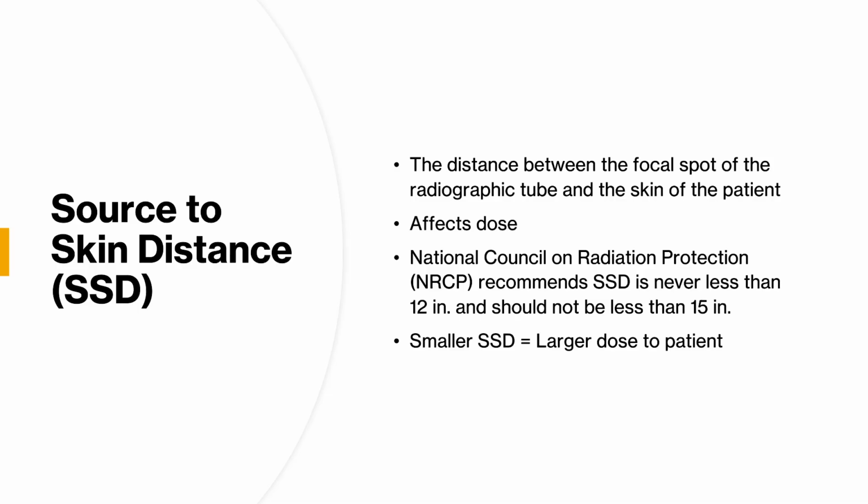We can also talk about the source to skin distance. This isn't something that you'll have to memorize as far as each setup having a specific one, but it is important to note that it will affect the dose of the patient. Like I was talking about before, the smaller the SSD, the larger the dose to the patient, because the closer you bring those x-rays to the patient, the more radiation they're getting.